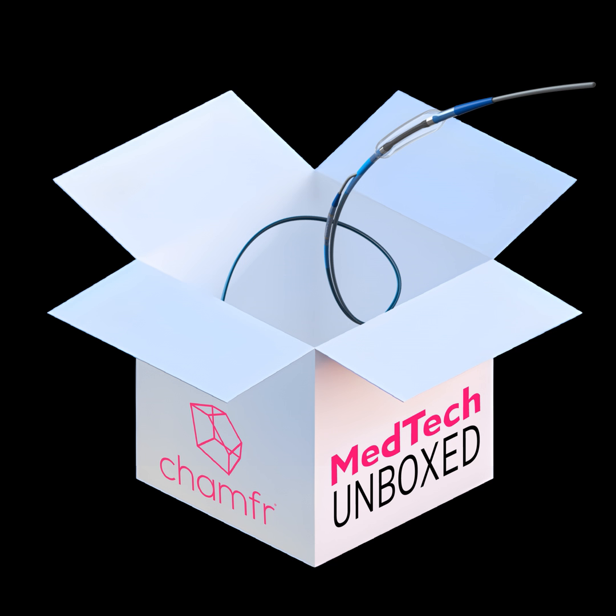Let's talk a little bit about, if you can, the future, the vision. How do you anticipate going forward with some additional advanced features? Like I said, I hope to be done adding things unless I get some really strong feedback asking for other features. I have 1,000 other ideas. I could keep adding things forever. I'm at the point now where I want to just get it out there and get into people's hands. And then at that point, build based on people's needs and feedback, not just what I think would be cool. Yeah, that makes sense.